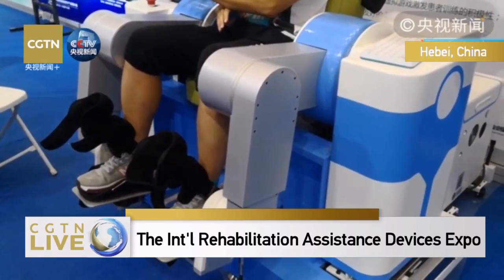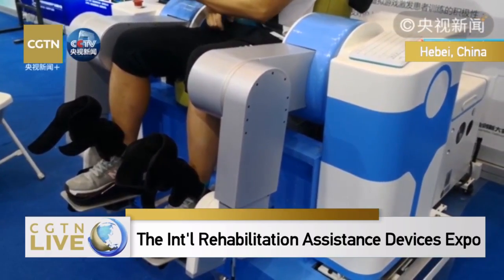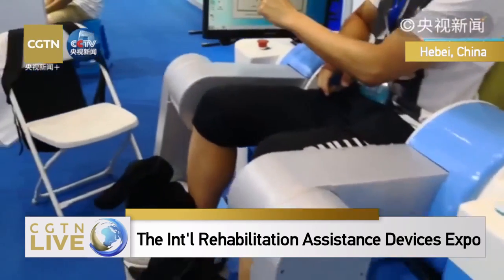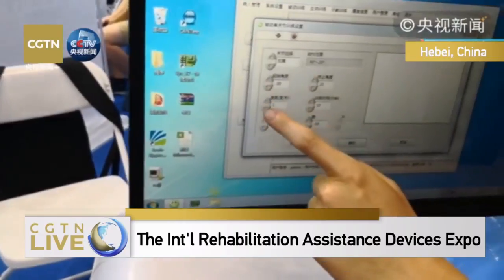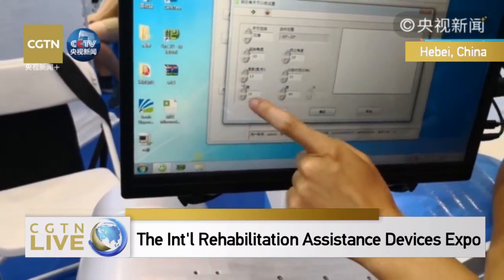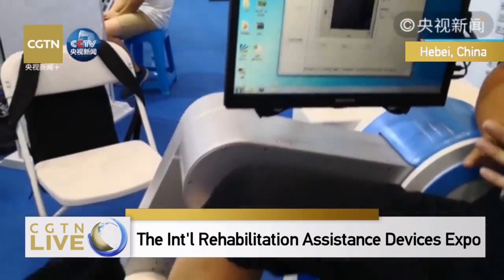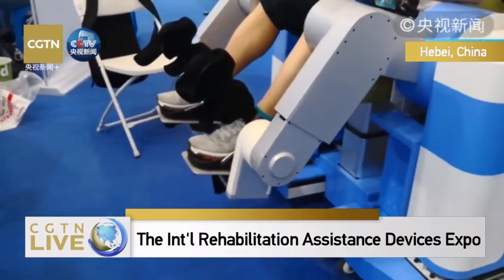This is quite a large device and takes some time to function. The good thing about robots is that once you set the program, it can be repeated thousands of times. In this way, its memory is much stronger than that of humans.